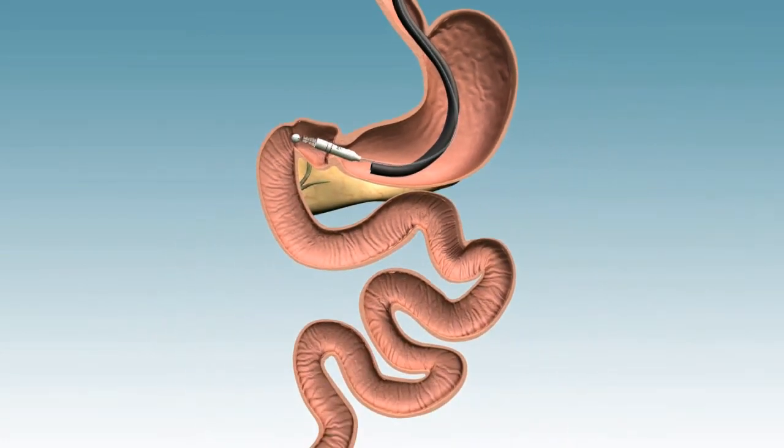Utilizing continuous dynamic fluoroscopy, the liner and atraumatic ball are advanced two feet into the proximal small bowel with the aid of the coaxial catheter delivery system.